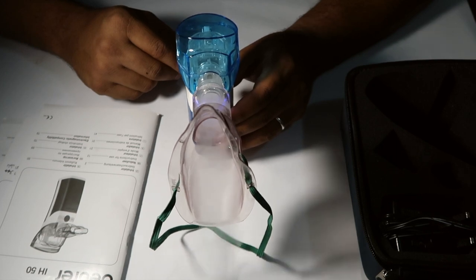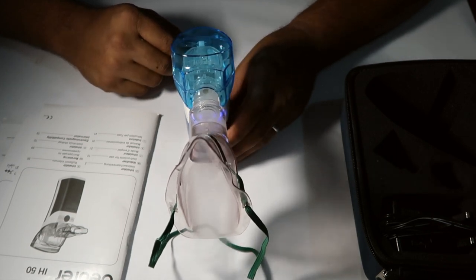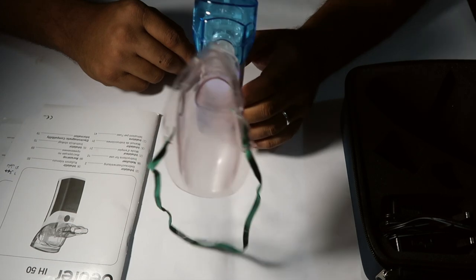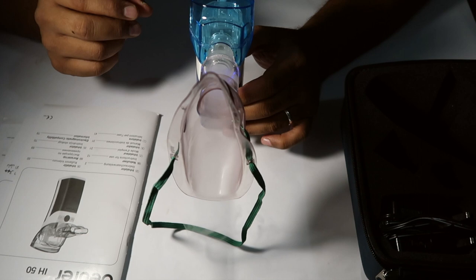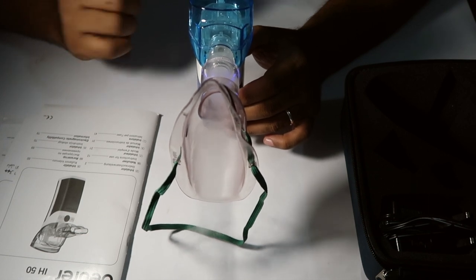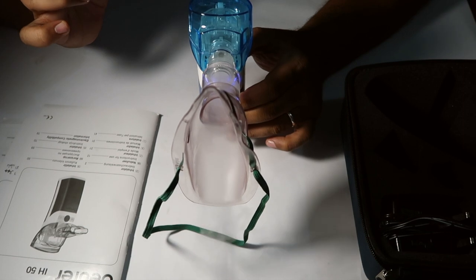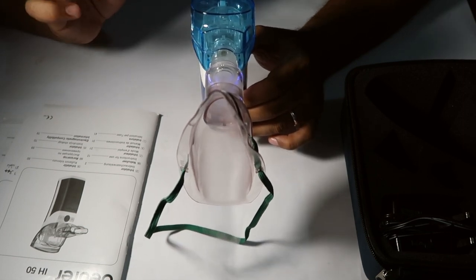This device is very useful and very soundless. If you use a nebulizer machine with a compressor, you can hear a light sound, but this one is much quieter.